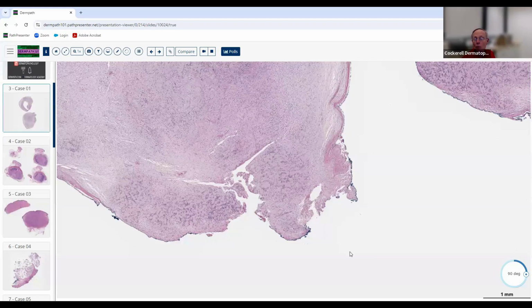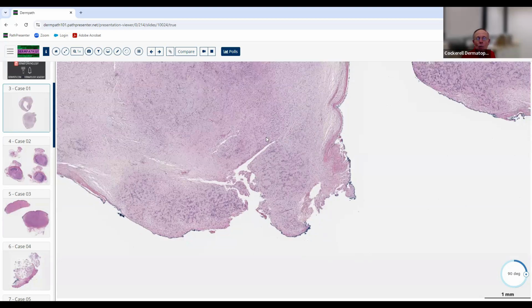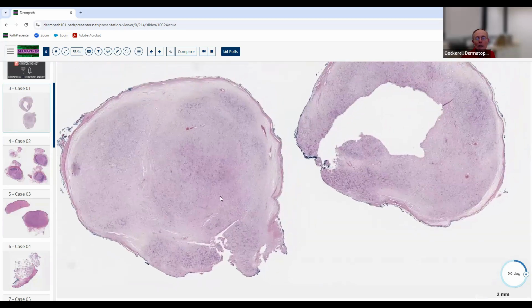You don't see any pre-existing nerve twig in a neurofibroma. In a schwannoma, it's like you took that hand grenade and walked on the outside of the nerve twig and set it off, and the lesion exploded off of the outer part of the nerve twig. That's what you get with a schwannoma. So neurofibroma developed within the nerve, schwannoma off the side of the nerve twig.